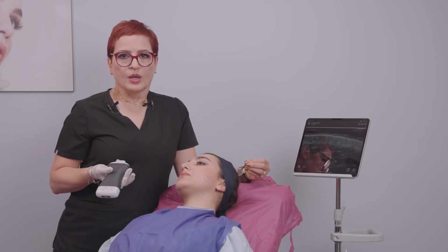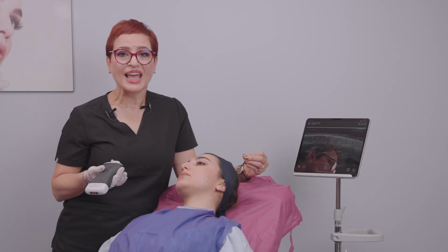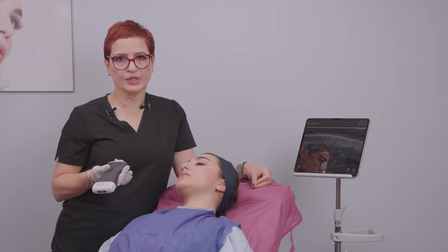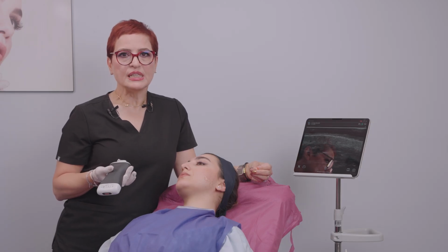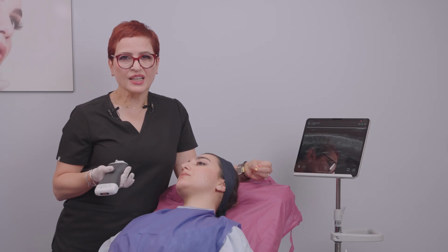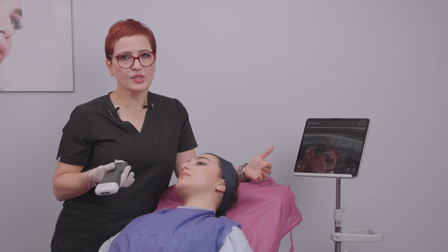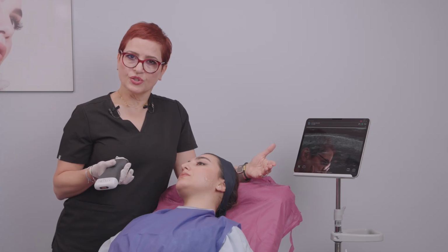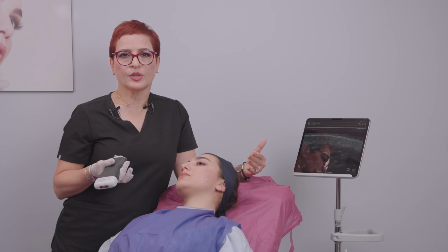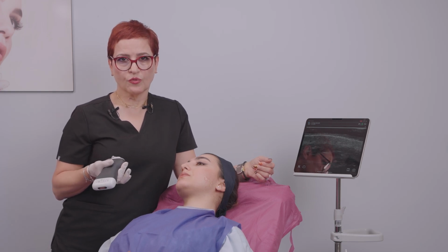My goal was to show you how you can use ultrasound to tailor the anti-aging treatment for your patients. Even the depth of the needle that you're using, even the depth of the energy release with an energy-based device, or even if your patient doesn't need any anti-aging treatment, only volumizing or a little bit of repositioning or any other treatment that your patient is looking for.